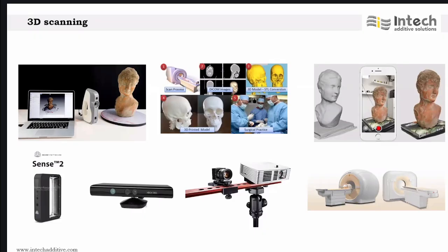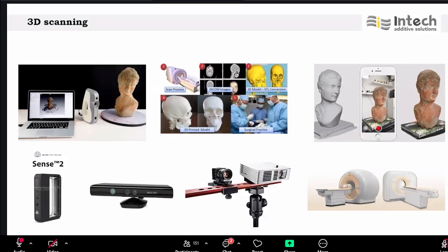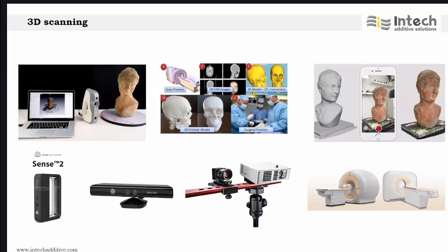3D model. And if you take medical applications and you are really interested in capturing the internal structures or internal organs, then we can go in for MRI or CT scan. Mostly CT is preferred. The sliced images are what we call DICOM images, where you have the sliced X-ray images which are stacked upon each other to create a 3D model. And there are some softwares to do the conversion from DICOM to STL or OBJ.